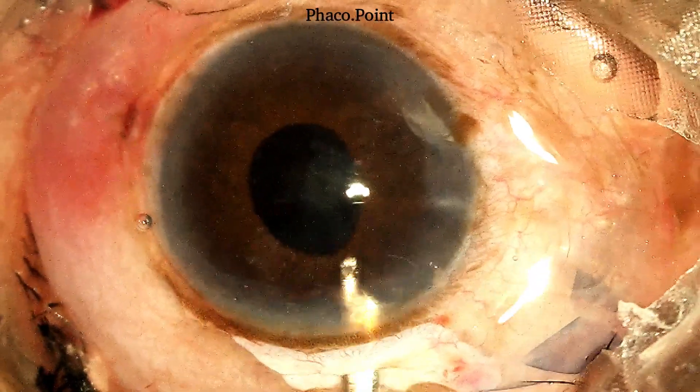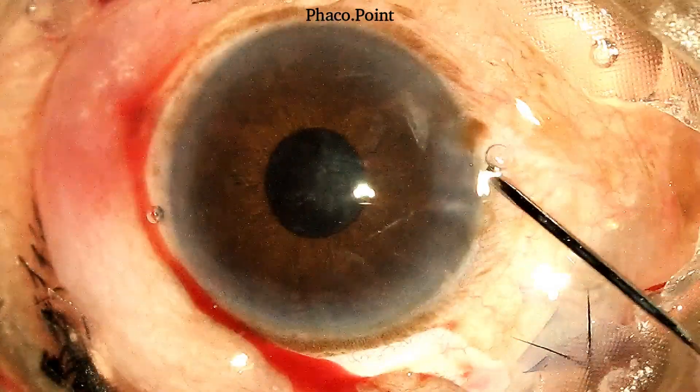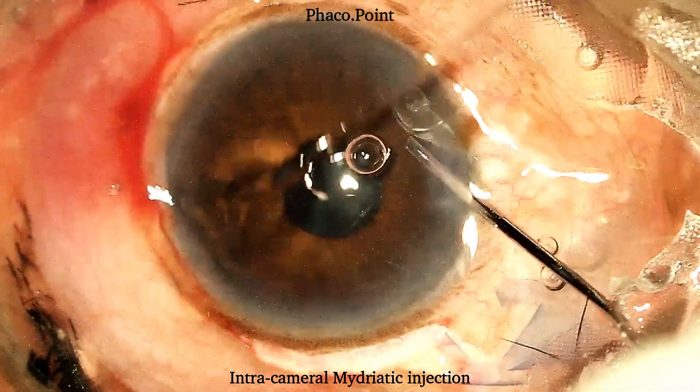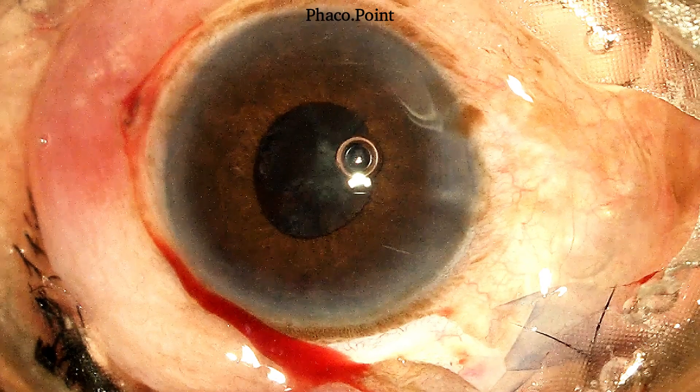You will note in this case that during the cortical wash, the pupil has gone down even further. It may not be a bad idea to introduce some intracameral mydriatic to try and get the pupil to dilate a little. With the pupil now slightly larger, the surgeon continues with the rest of the irrigation aspiration.